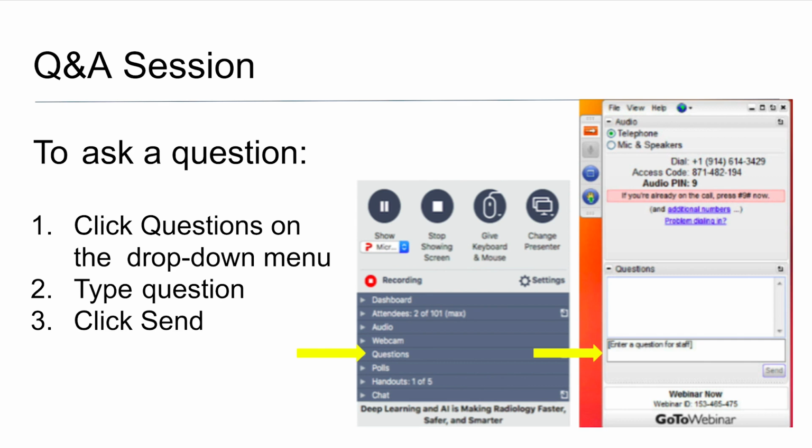And one of the major issues is compressed sensing is based on a more simplified signal model. So basically you have a predefined signal model, say the image has to be sparse or minimize a certain norm in a certain transform. This limited its results because usually the image looks different than if you collected a full dose scan or full scan like MR or CT or PET or other image modality.